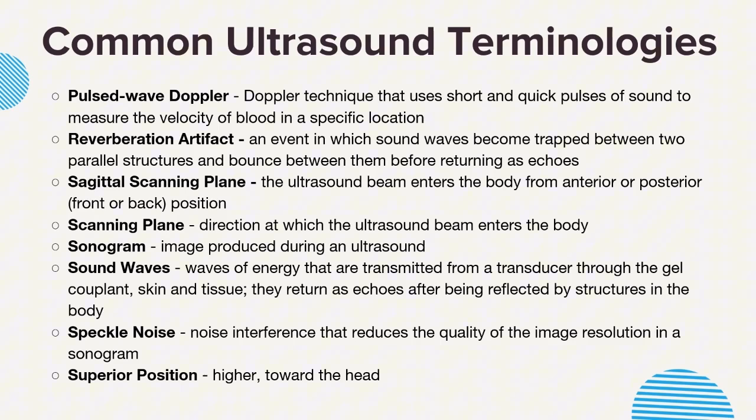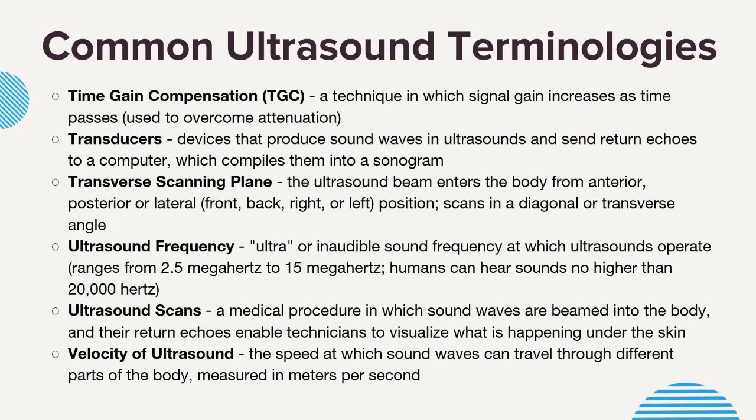Speckle noise: noise interference that reduces the quality of an image resolution in a sonogram. Superior position: the higher position, towards the head. Time gain compensation, TGC: a technique in which signal gain increases as time passes, used to overcome attenuation.